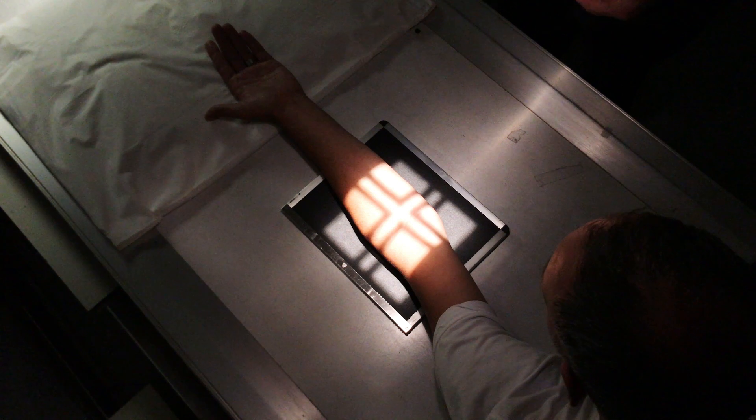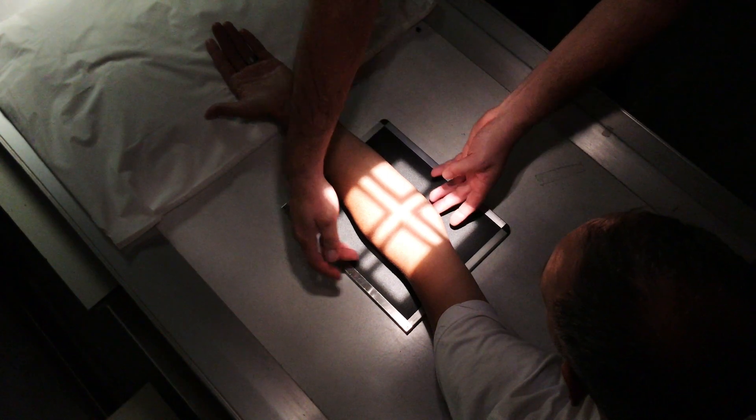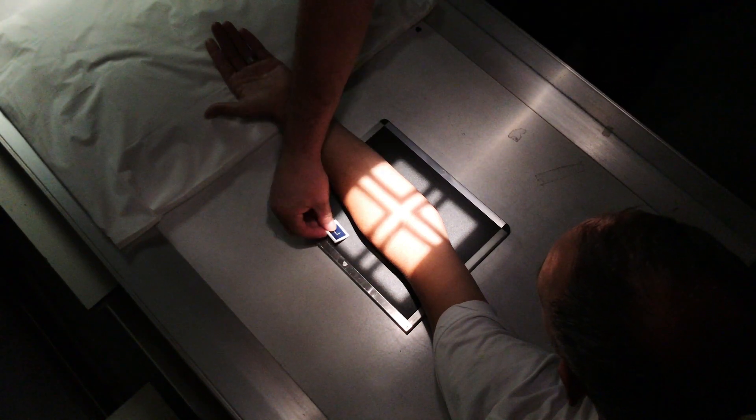Our first view is going to be AP. Make sure the radius, the ulna, and the humerus all have contact with the image receptor. To make sure that your elbow is in a true AP position, make sure the epicondyles are parallel to your image receptor, and always mark your image receptor.